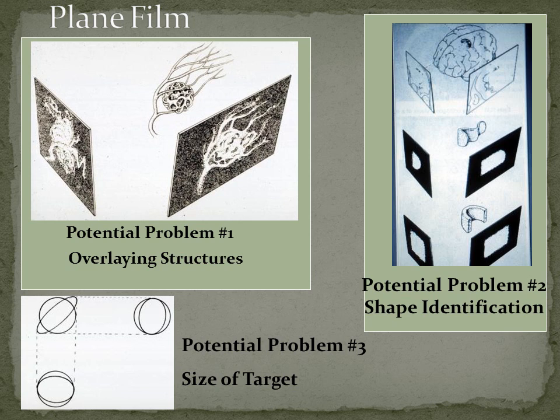The other thing that happens is that because you don't know the surface shape, when you project things down, you don't know if this ellipsoid or circle is being projected. They both project with the same diameters in these 45-degree views, and you can start making size errors as well. So there are a whole host of problems that angiography presents to you that need to be rectified.